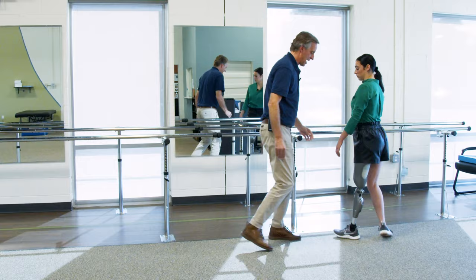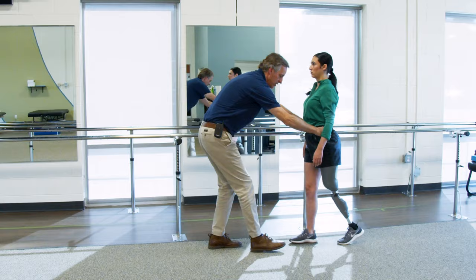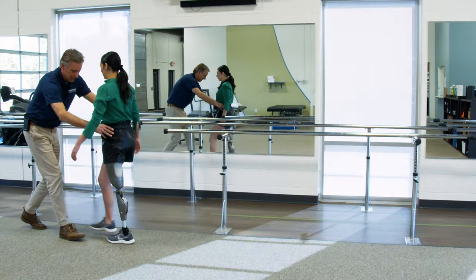We'll come on back. Same principle. If I'm in front of her, I can be here and just say, okay, take that weight, push at me. Good. Push at me. Push me out of the way. There you go. Nice. And relax.